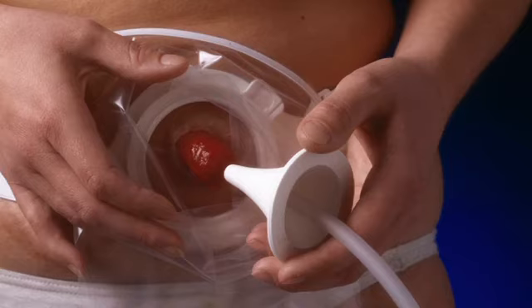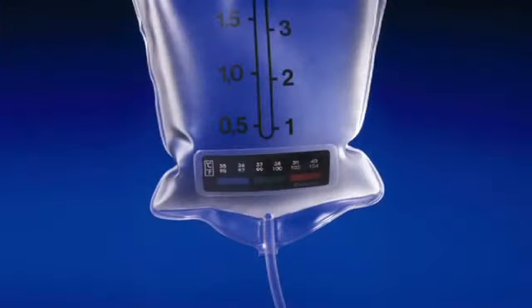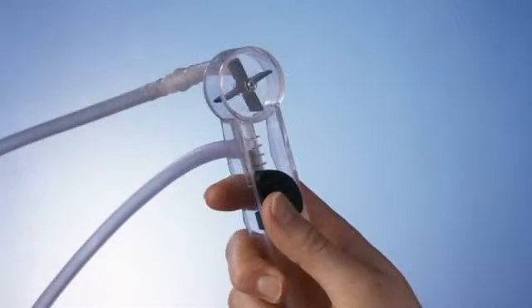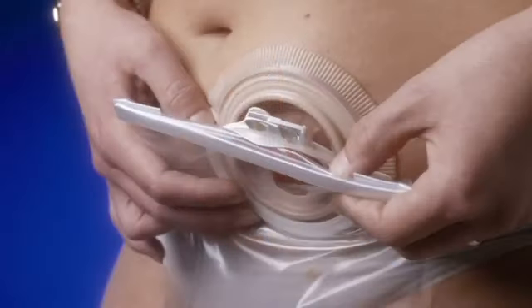To perform the irrigation procedure you will need an irrigation bag to contain the water for the irrigation, a cone to be inserted in the stoma and lead the water into the stoma, a regulator to regulate the flow of water into the stoma, and a sleeve to be attached to the base plate and lead the evacuation of feces from the stoma to the toilet.